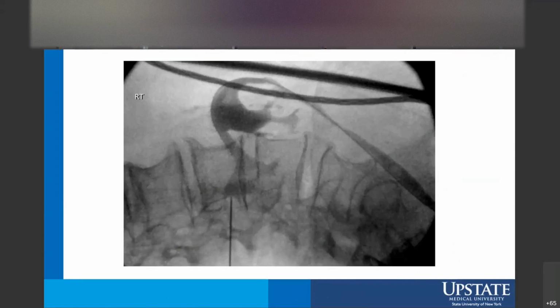So this solution, looking for that posterior lower pole calyx, doesn't always apply. Sometimes we have to make adaptations, but fortunately this technique is applicable to other variant anatomies, and so we were able to get satisfactory upper pole access in this situation using that same technique. What I do like is the ability to orient the needle in line with the target calyx. Here we had a really nice trajectory all the way to that renal pelvis where we could get our stone.